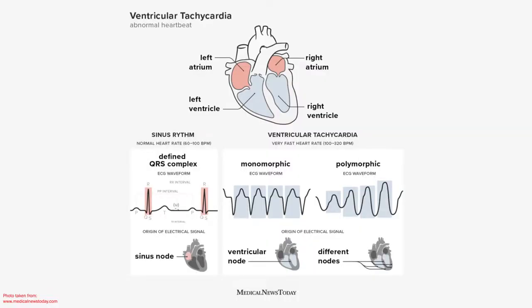And then the scary one is VTach as well. This VTach means that your heart rate is well above 150. The monitors are going to read like 172 something. There's no clear P, QRS, or T, and they look like tall, skinny mountains. Like me learning how to write my name in kindergarten, M.